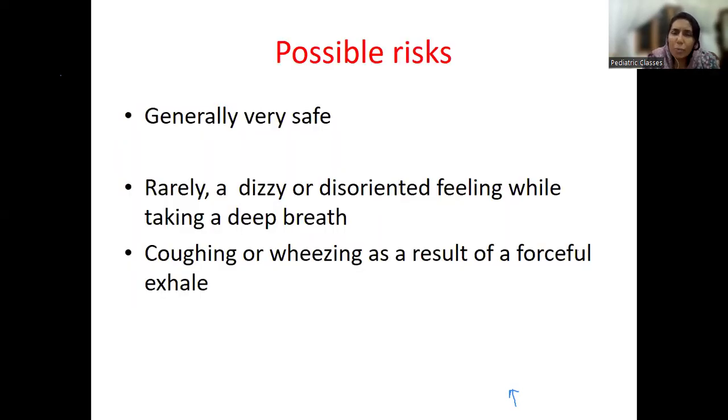Is there any possible risk while doing a PEFR? Generally, this PEFR is very, very safe and very, very easy to do also. The only thing is we have to make sure certain things are done properly. Like I told you before, the pointer should be at zero, and I have to tell the child very properly to give a proper exhalation so that there is no leak.